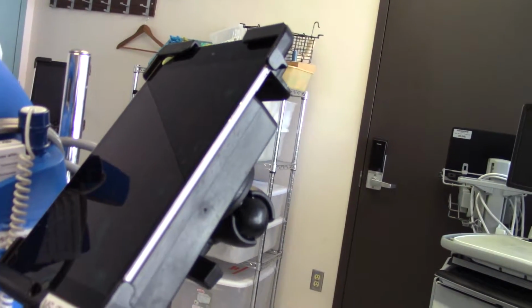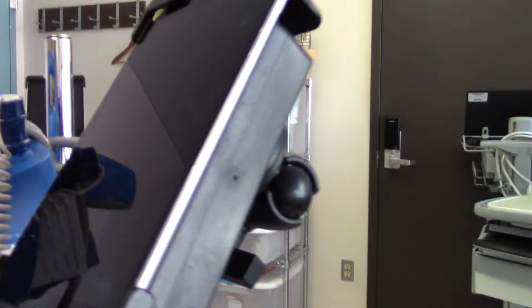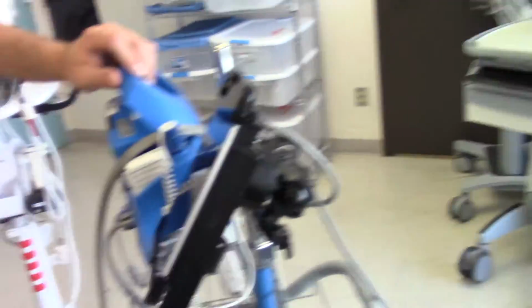And there's also chemical intrusion to be considered with these because they are sanitized. Being that they're in and out of patient rooms, especially if there's a C. diff patient or various infection control measures, they have to be protected from bleach, quaternary ammonium, alcohol, and all the various cleaners, disinfectants and antiseptics that they use. As of now, they're just sitting out here bare, and a lot of times we don't see a lot of seeping in around the screen.